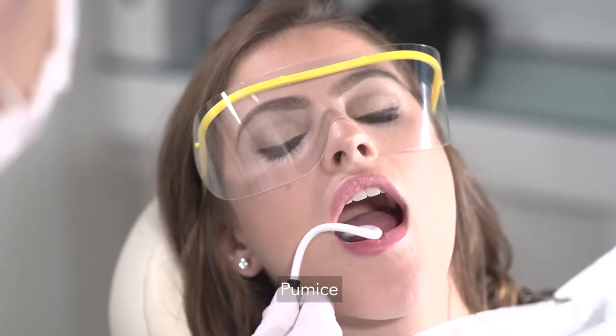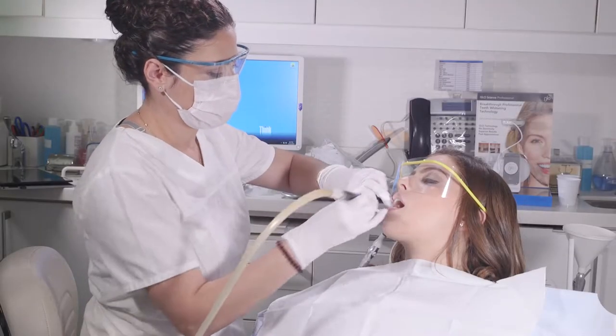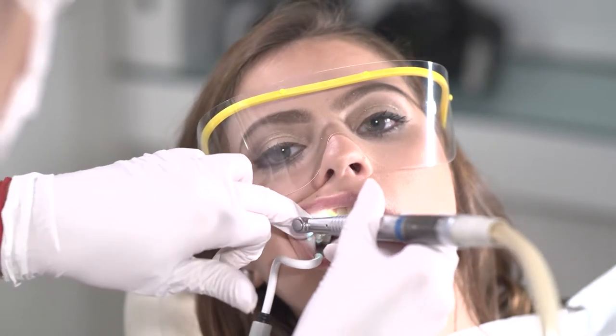Pumice the patient's teeth to remove surface stains and biofilm so you have a clean enamel surface for whitening. This allows the hydrogen peroxide whitening gel to be in direct contact with the enamel for the best results.